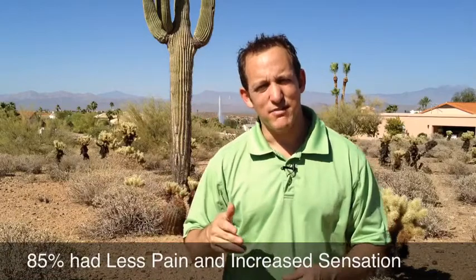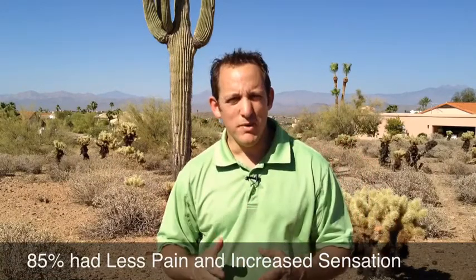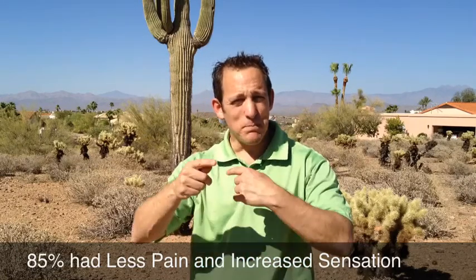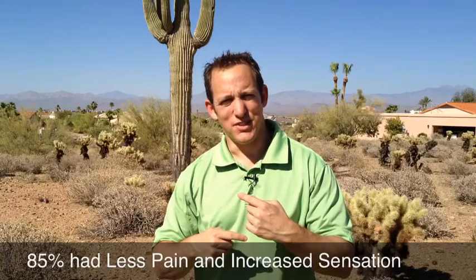Spinal cord stimulation for peripheral neuropathy, specifically diabetic neuropathy, has worked really well in past studies for pain relief. What it does is it sort of tricks the brain into perceiving differently the way these pain signals come in, so patients have less pain. The recent study out of Evansville, Deaconess Hospital, looked at quite a few patients with this problem who got spinal cord stimulation. And they found that 85% of them actually had improvements in their sensation. And 58% of the patients in the study had a complete reversal of their loss of sensation in their feet.